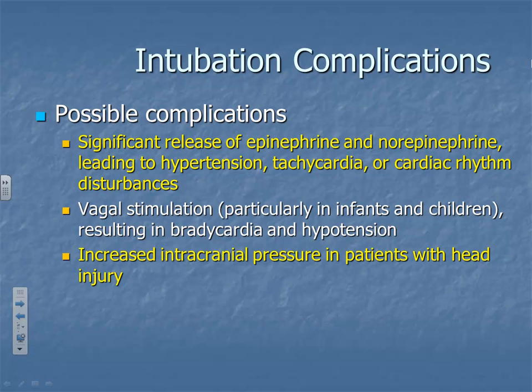Now, patients with a severe head injury, we like to intubate them early because that pressure on the brain can cause trismus. It's not Christmas. Trismus, what is that? Clenching of the teeth. So if they clench their teeth down, it's going to be very difficult to intubate them. How will you be able to intubate them if they've got clenched teeth? Could you do a nasal on a patient with a head injury? Probably wouldn't do it there. So that's why they're introducing paralytics.